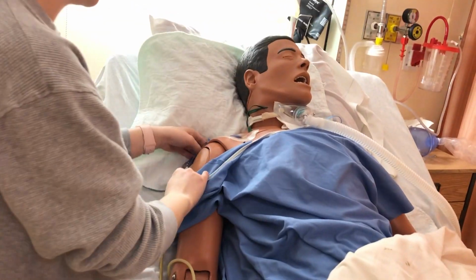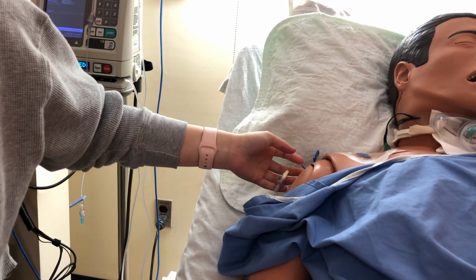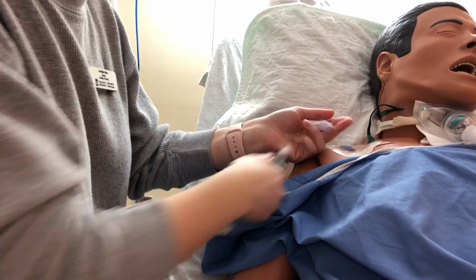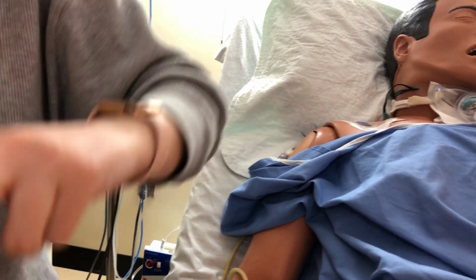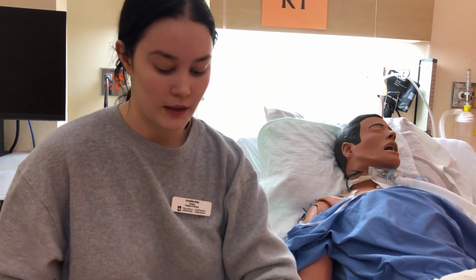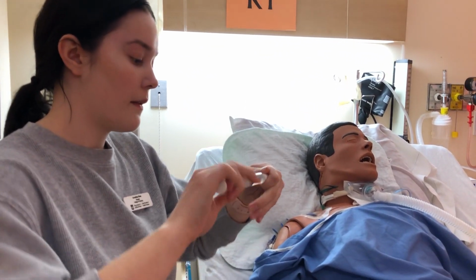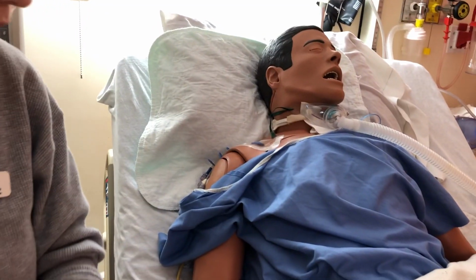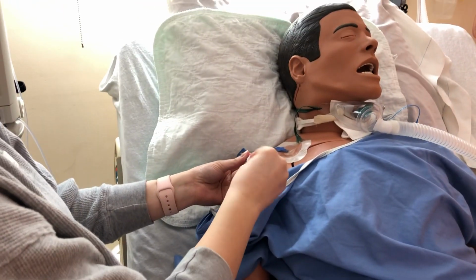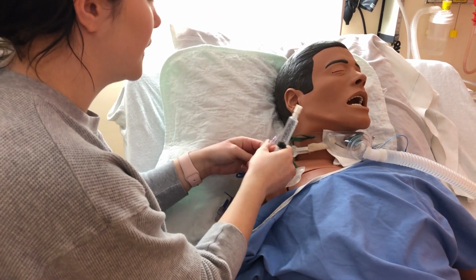Okay, so just gonna do some hand hygiene again. So my patient is supposed to get it through the central line. I'm going to be using the white port, and I'm just gonna check to make sure that it's patent. I'm just gonna set up my flush beforehand. I'm gonna grab the other one because my hands were a little too shaky. Okay. So I'm going to swab for 30 seconds and allow it to dry for 15.